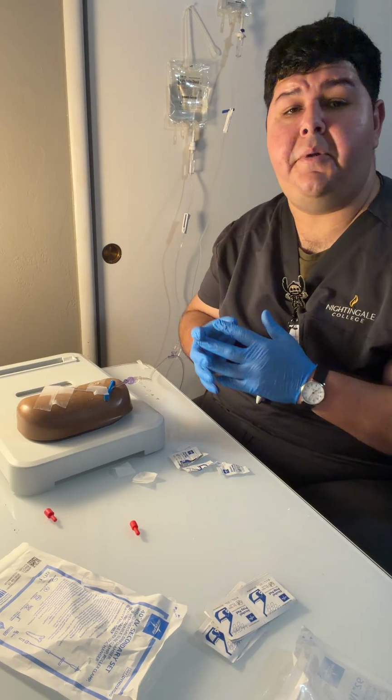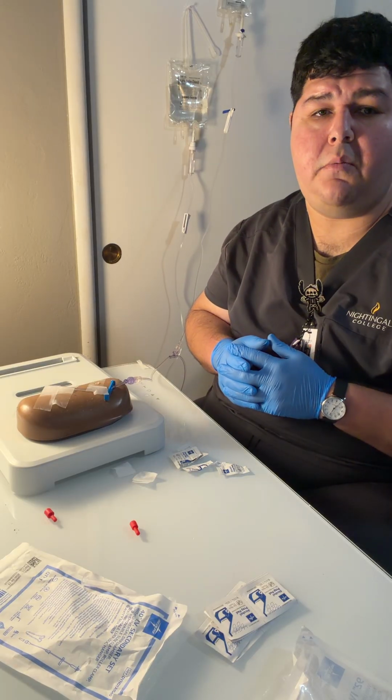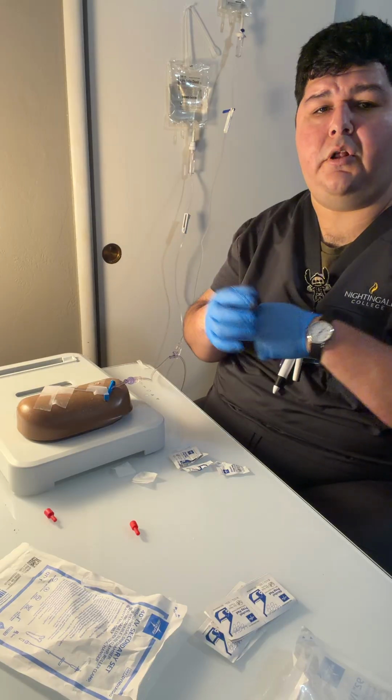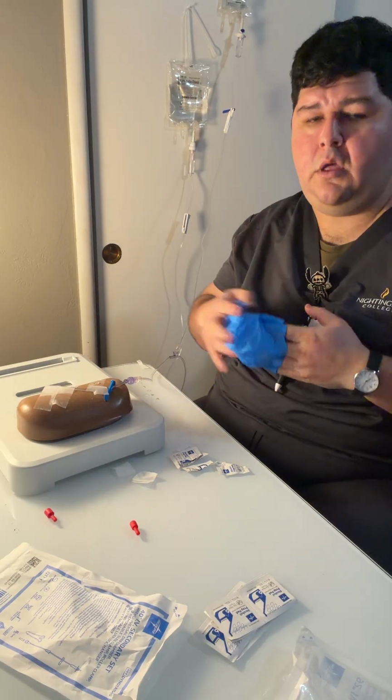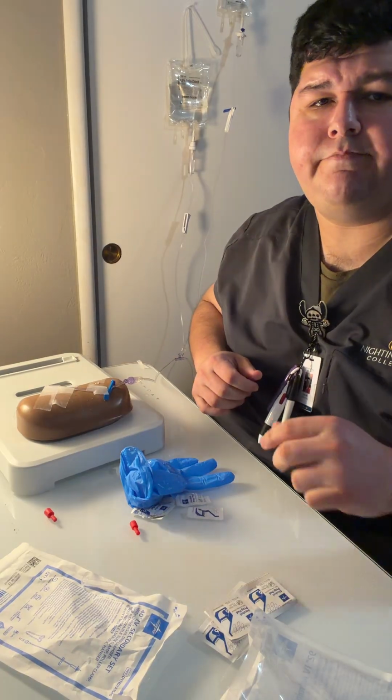At this point, we're going to place our patient in a position of comfort. We want to ensure that the call light is within our reach. We're going to go ahead and remove our gloves, discard our supplies, perform hand hygiene, and then document our procedure. Thank you very much.